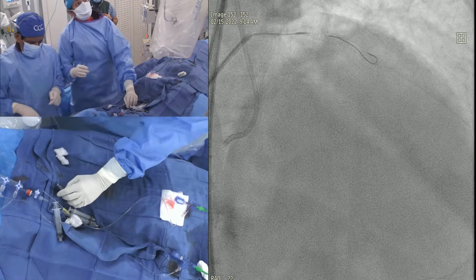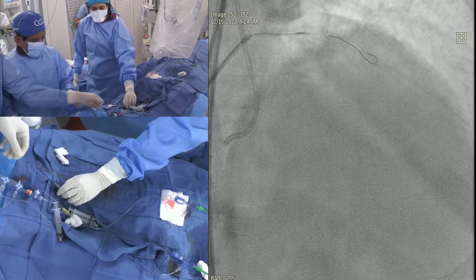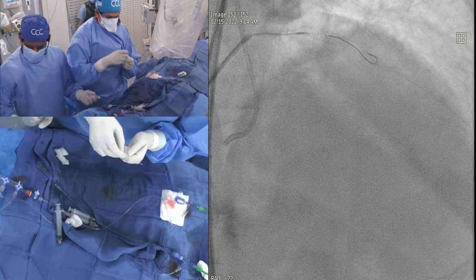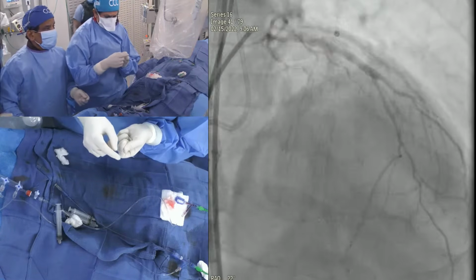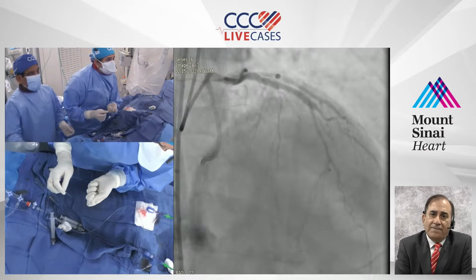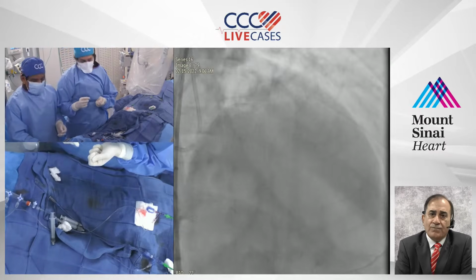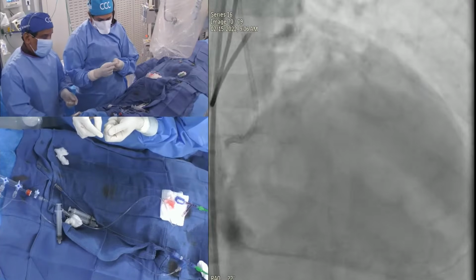Question is, did the stent go into the diag, right? No, it looks short of it, but it did strike me in the first picture you took. Maybe not sure. Yeah, that's the reason we are not getting into the diag. So that stent is in the diagonal. So forget it. That's why.